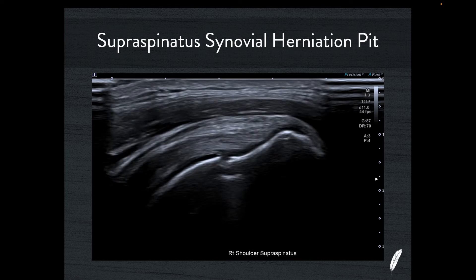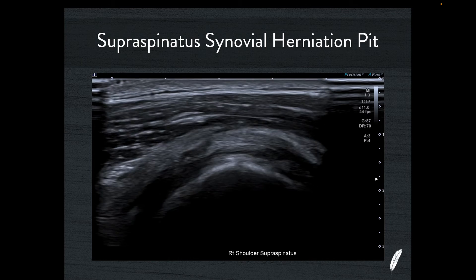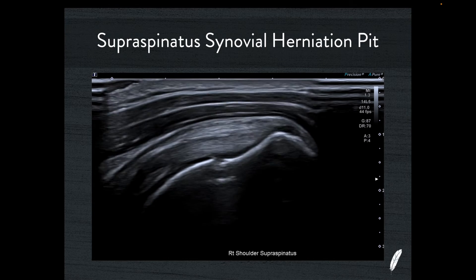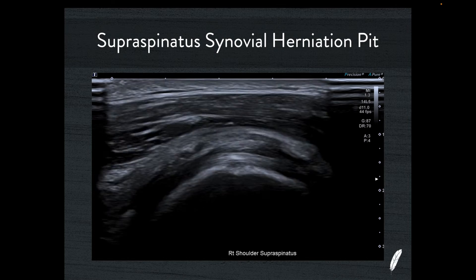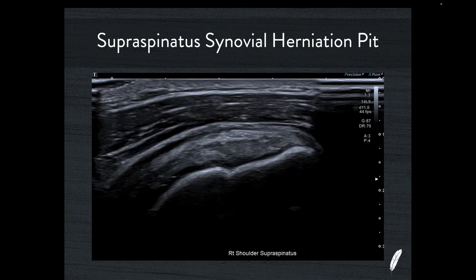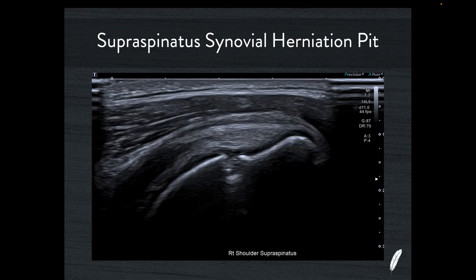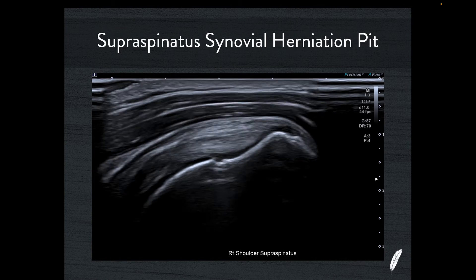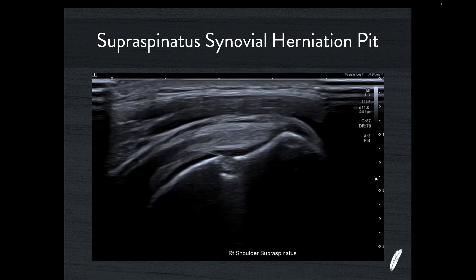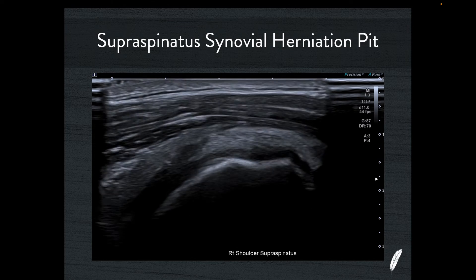Let's go back and look at the synovial herniation pit again. You can see the difference — the synovial herniation pit is much, much closer to the hyaline cartilage. It's really immediately adjacent to it because this is the bit of real estate that the glenohumeral joint capsule uses to attach onto the greater tuberosity — its own little enthesis. And if you look at the collagen immediately superficial to this synovial herniation pit, you can't fault it. It looks perfectly normal. This is coracohumeral ligament, rotator cuff cable collagen that is in the pink of health. There's no problem here.